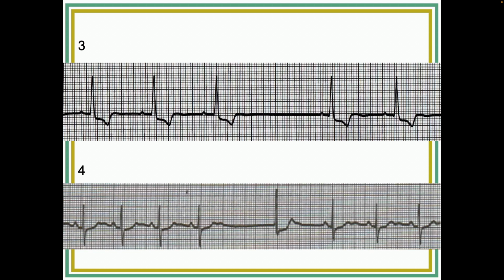premature beat? Why does one happen, why does the other one happen? Yeah, Andrew. An escape beat happens when the heart's SA node doesn't fire, so the ectopic focus then is irritable, and so it fires, and a premature beat is just where the heart gets stimulated too early. Okay, so in one, it's already irritable, the premature beat. The other one, it's made irritable by this pause here.